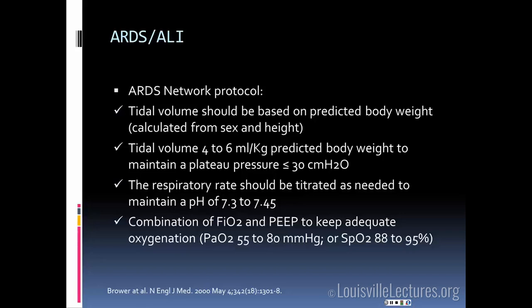And the PEEP you're going to choose is going to be based on how much FiO2 the patient is requiring to keep this oxygenation. So there is a PEEP FiO2 table that you're going to be using at bedside to select the PEEP you want your patient to get.